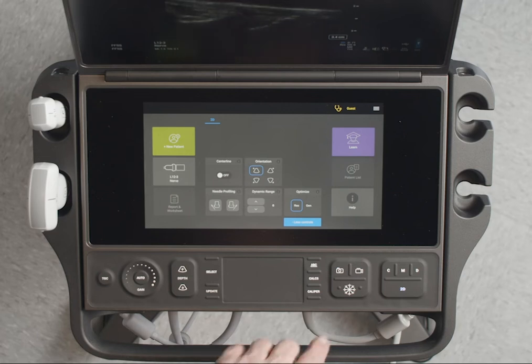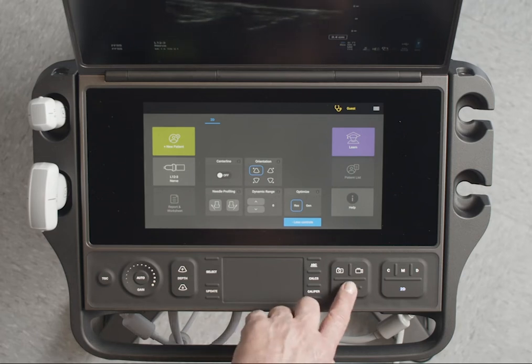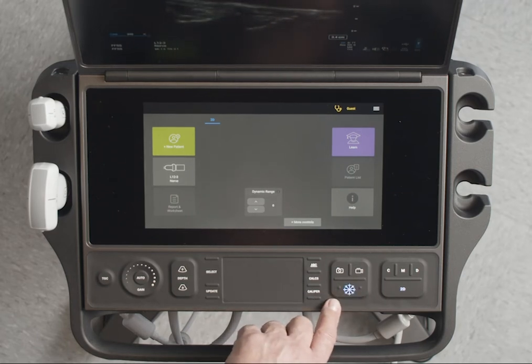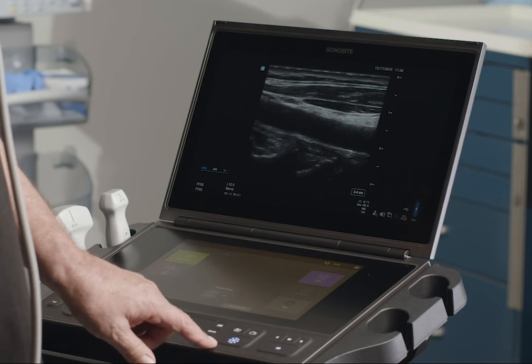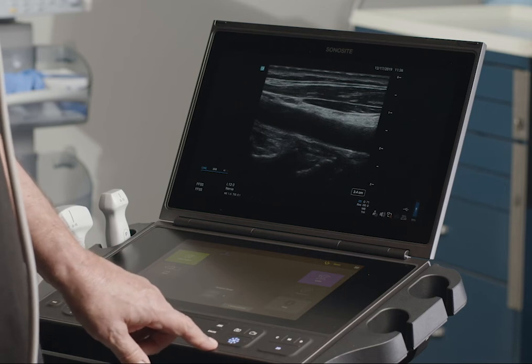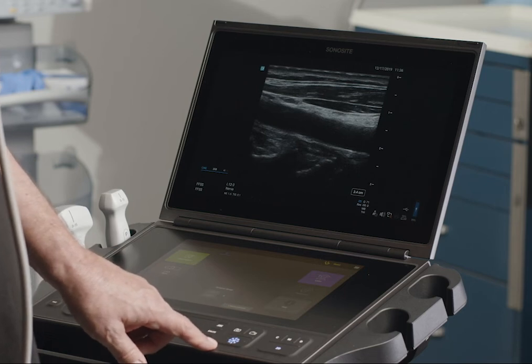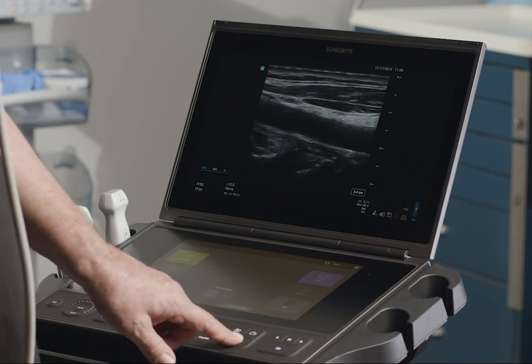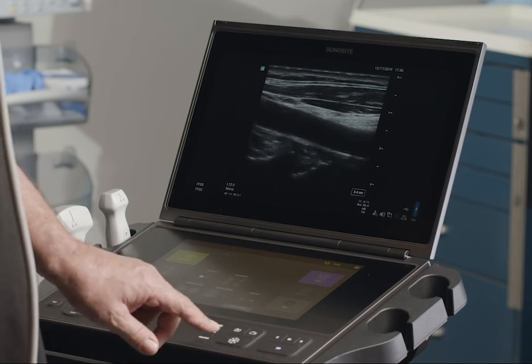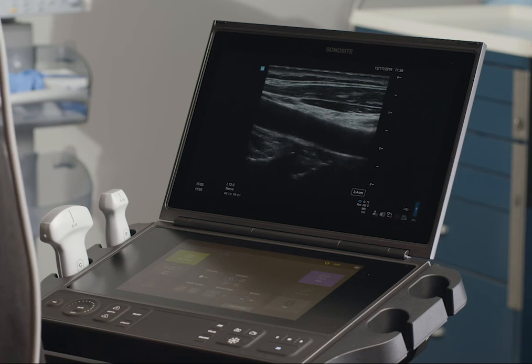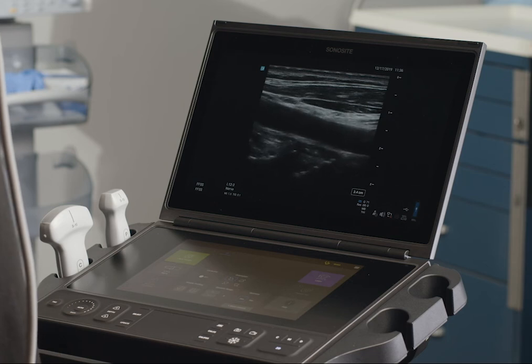Now that we've optimized the image, let's freeze it by pressing the Freeze button. Now that the image is frozen, you can take a measurement. For more details about taking measurements and calculations, watch the help video: Taking Measurements.